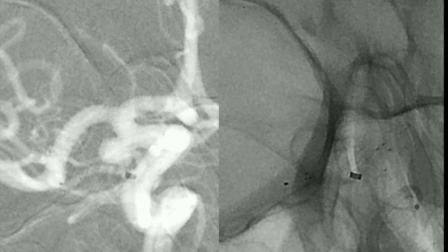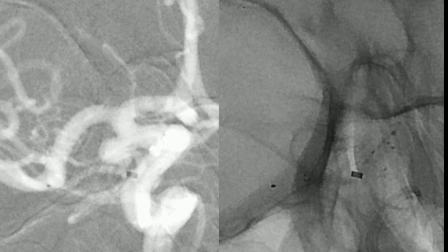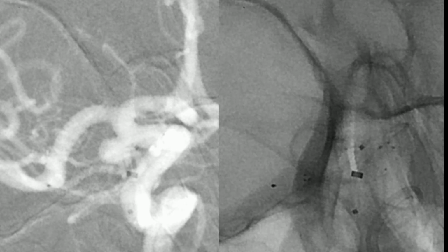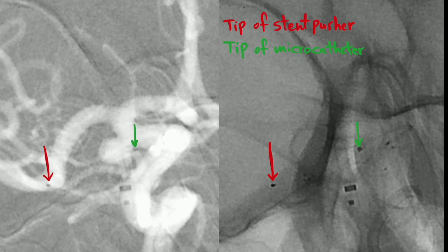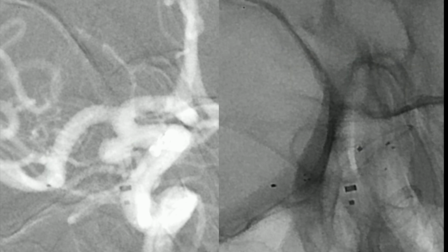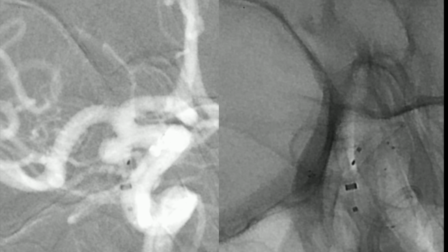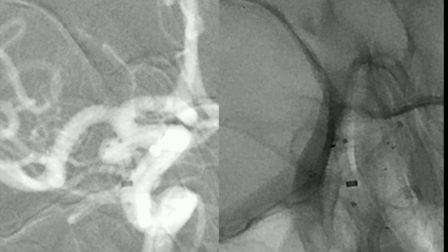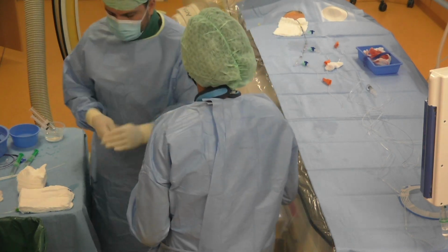And now we will try to navigate the aneurysm sac with the help of the pusher of the microstent. We put the tip of the microcatheter at the neck of the aneurysm, and in red we have the distal end of the pusher of the stent. We pull it back, and then we push it in the aneurysm sac, and then we bring the microcatheter tip in the aneurysm sac. Now the pusher is in the aneurysm sac, and we push the microcatheter tip in the aneurysm sac. And now we can start the coiling.